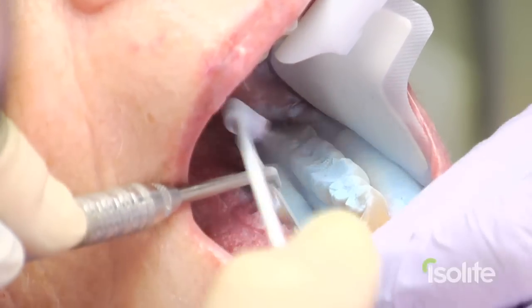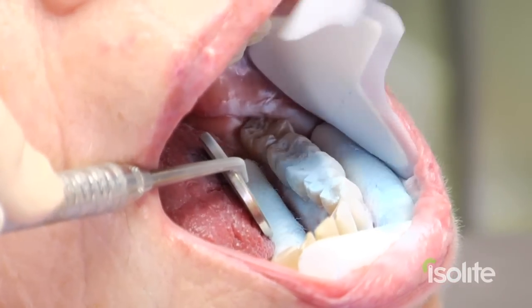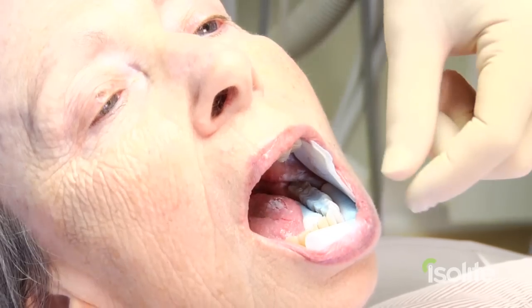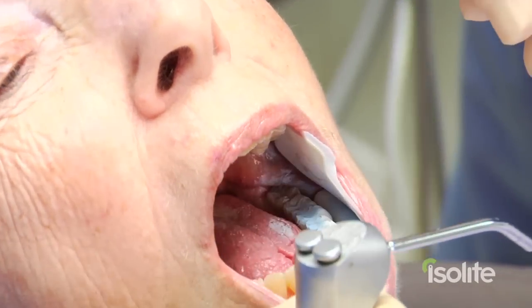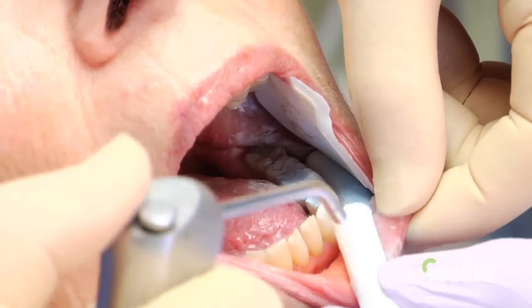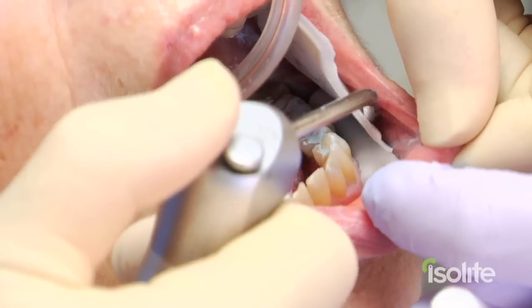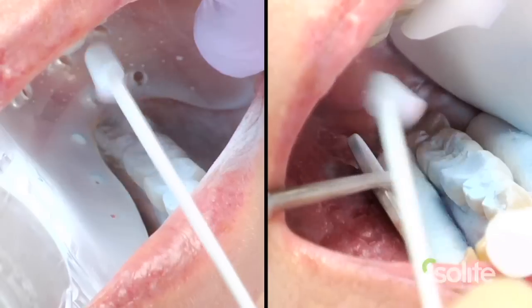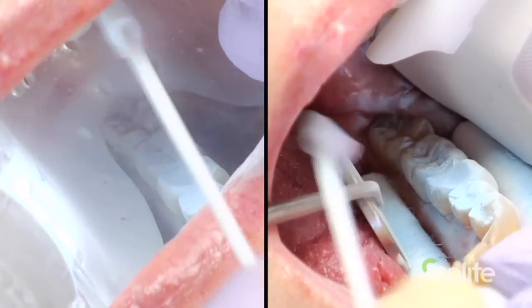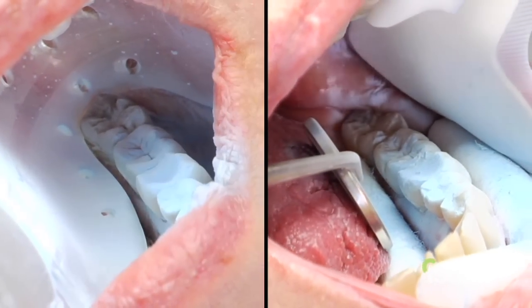I can, but it's a lot more work for me. It's a lot more work for the patient. It's a lot more work for the assistant. And now our mouth is full of cotton, and we've got to go back and take out the cotton — it's just a time-consuming process. You've got to worry about cotton roll burn. Now we've got to moisten the dry angle to get it out. So you can see it's much more cumbersome when we utilize cotton roll isolation as opposed to isolate isolation.